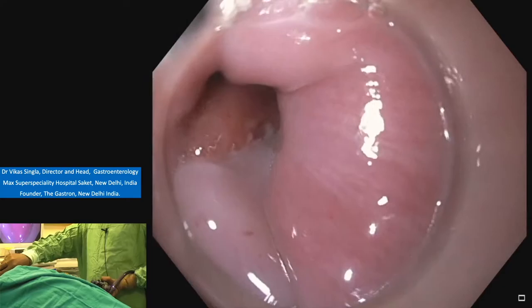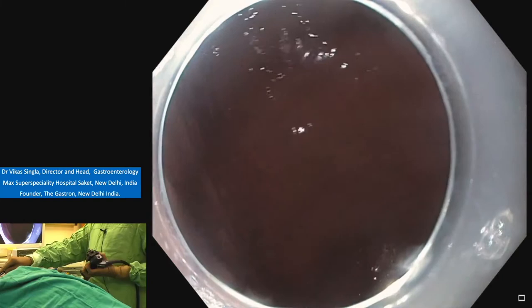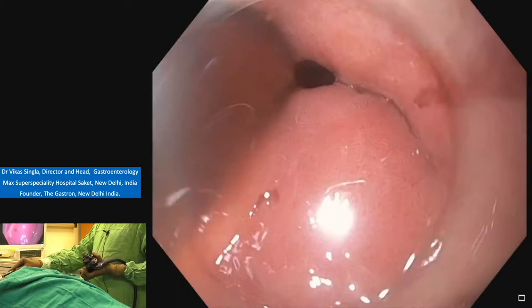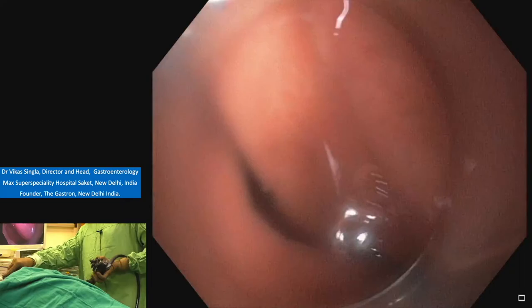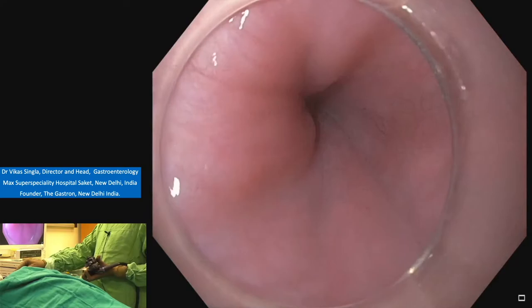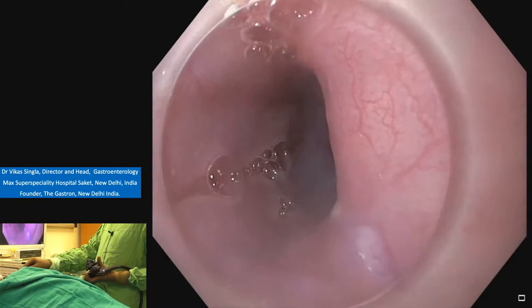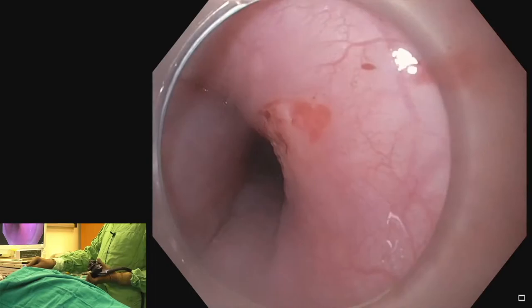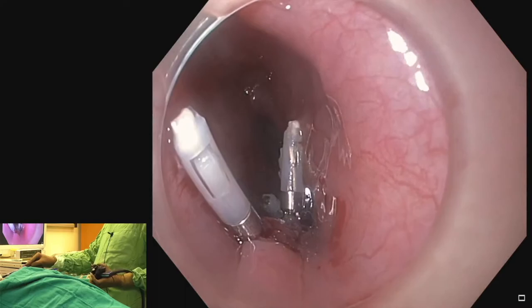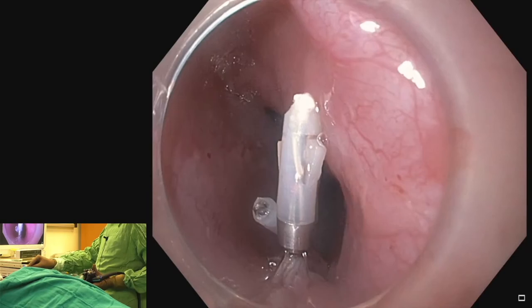It's open GE junction. Again, bring the suction. Suck out all the fluid so that there is no problem during the extubation. There is no risk of aspiration. Okay. We look for any mucosal injury, which I don't think there is any. Pull back. Some blanching of mucosa, nothing to worry. Pull back. That's our incision, which has been closed completely. Seems to be optimum closure, yes. Seems fine.